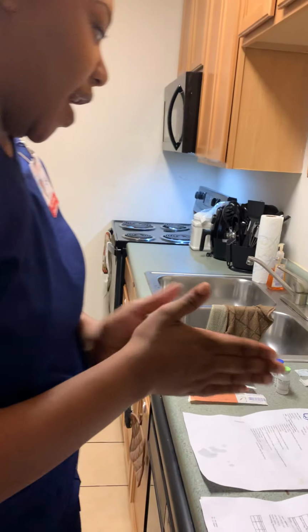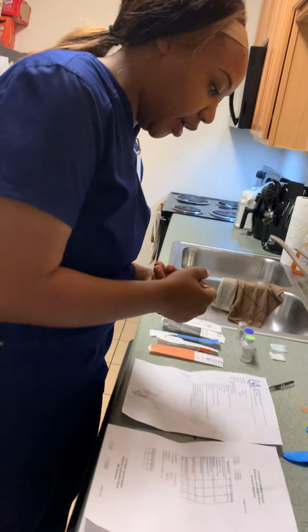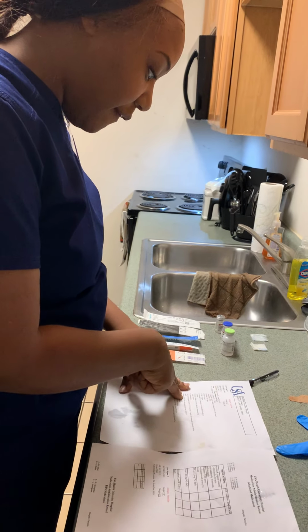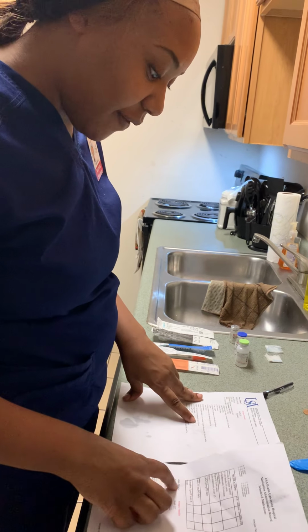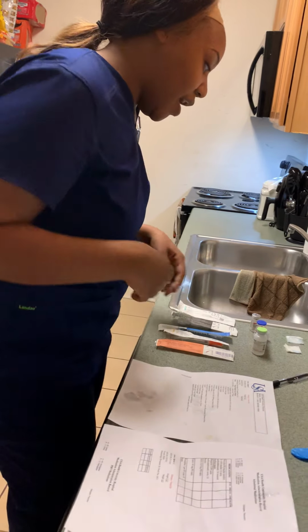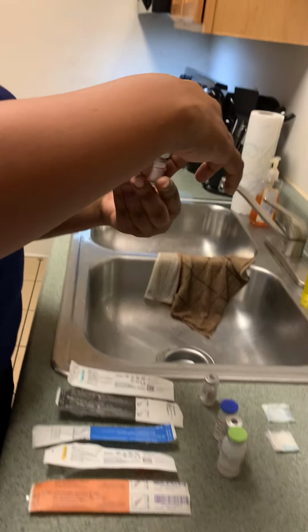I will be performing hand hygiene, and I will check my medication record and order form once again. I need heparin at 5,000 units subcutaneously every 12 hours. I will perform hand hygiene, and I will retrieve my heparin.